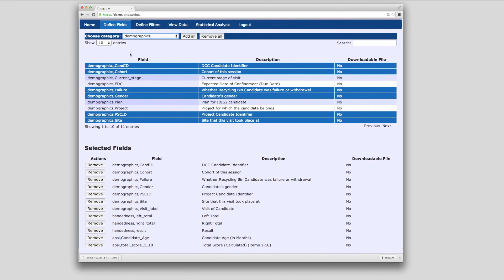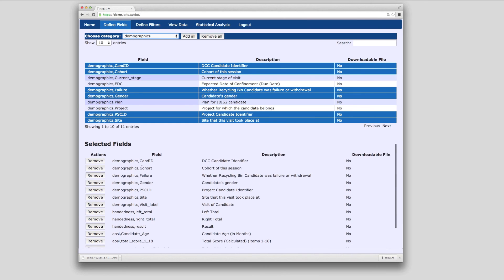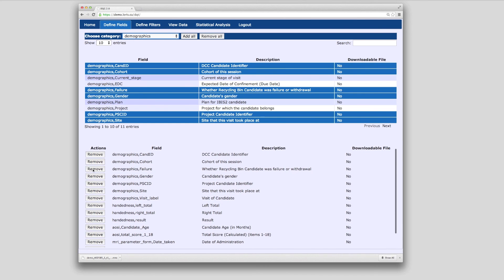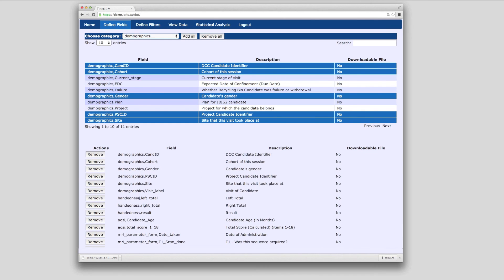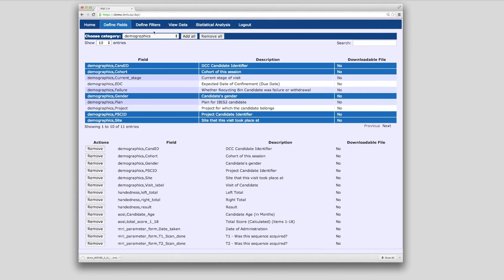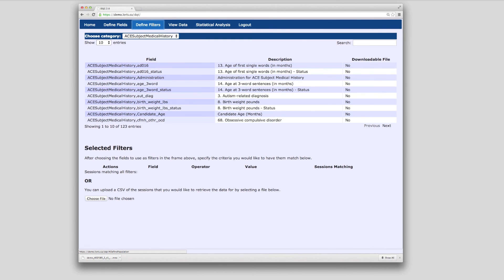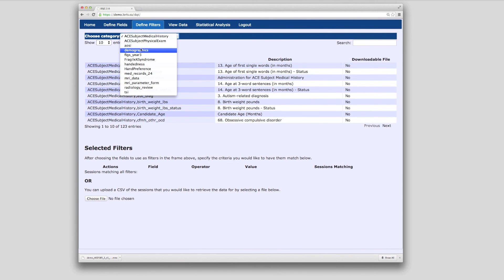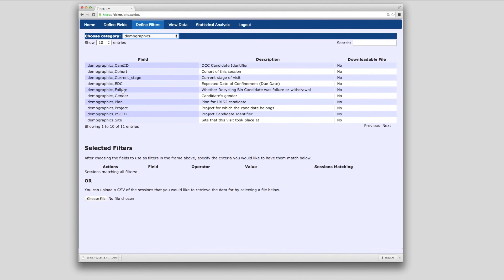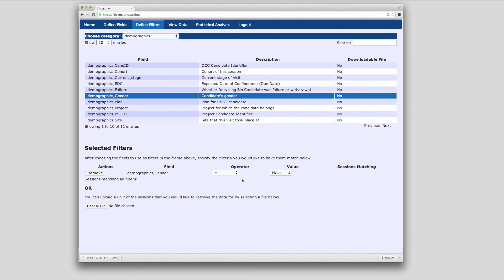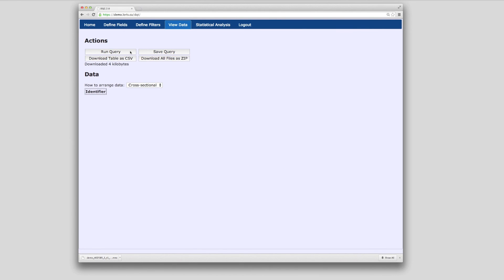Fields are organized by categories such as demographics or instrument name. Under Define Filters, any filter can be applied to the query — meaning any data element can be used to restrict the data results, for example gender or site name. To view query results, click on Run Query.